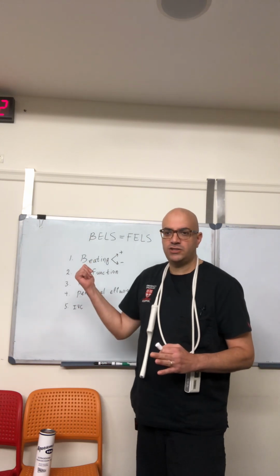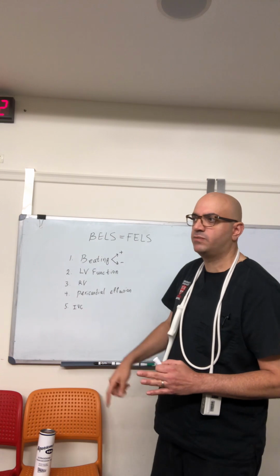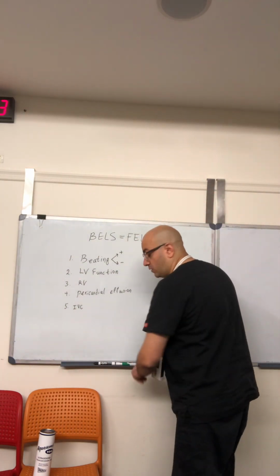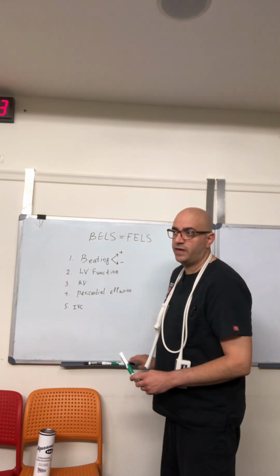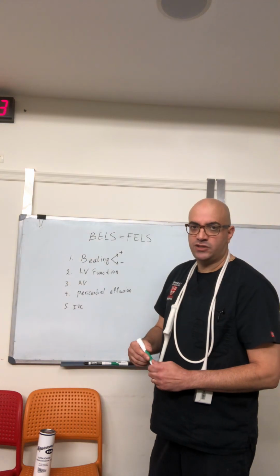So my suggestion is, if you can answer any of these questions, you tick it and you go to the next, but a lot of the time you need more than 1 view. We can talk in another video about how we achieve 5 views and put it on the channel.